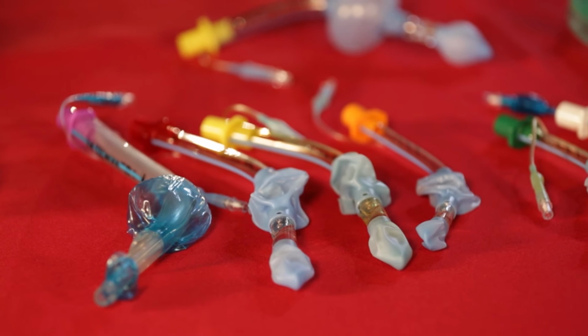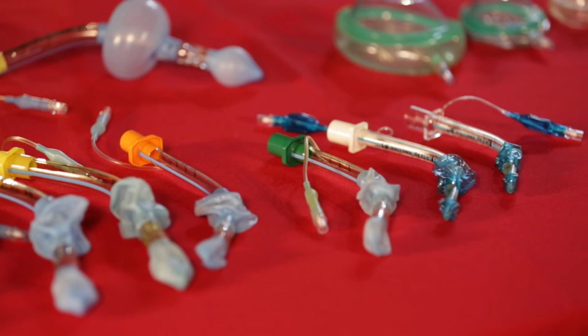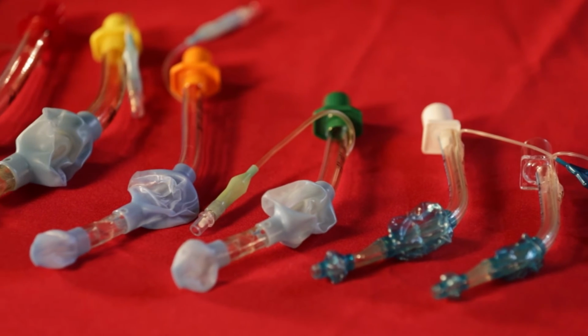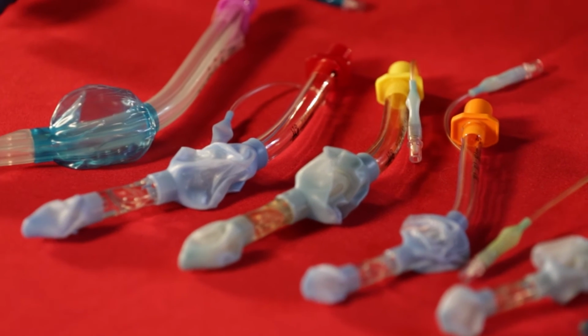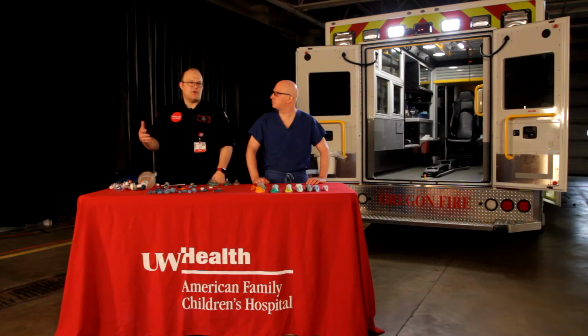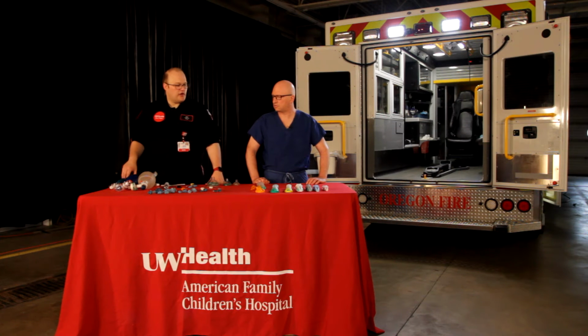For the King tubes, you gotta be a little bit careful because there is variation within the Kings. So for the smaller sizes, things smaller than a 2, so the 1.5, the 1, etc., those are gonna be weight-based, and the 2 on up, those are gonna be height or length-based. So you just wanna make sure you know, based on your availability of products, how you size what you have. So really get to know the product that you have at your individual service, but know that there's all these options, which I had no idea.